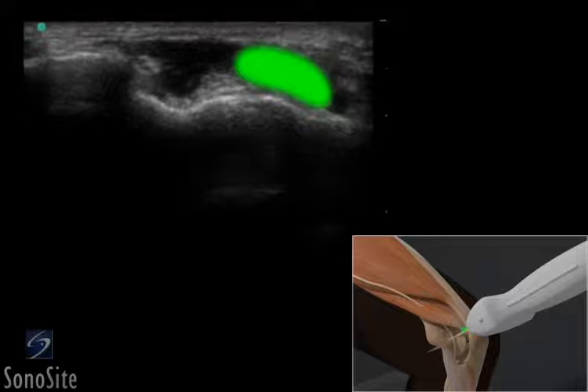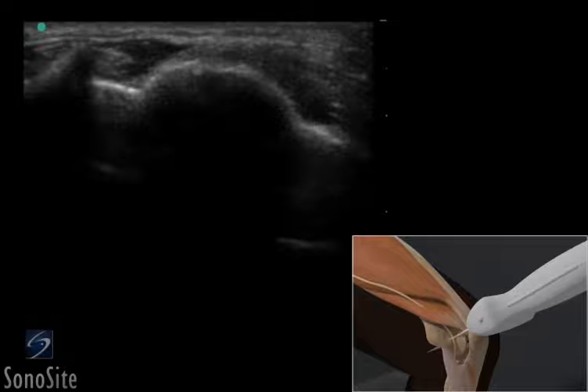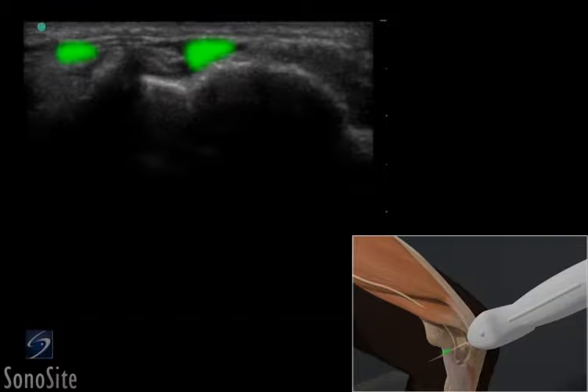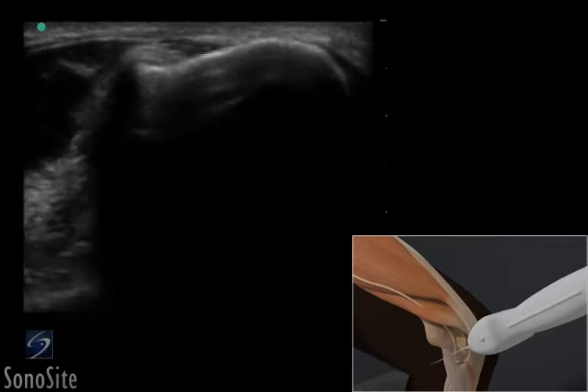The triceps tendon is seen as a hyperechoic speckled structure. The transducer is slowly translated down the cubital tunnel. The ulnar head and the humeral head of the flexor carpi ulnaris muscle can be seen as oval, hypoechoic structures surrounding the ulnar nerve.